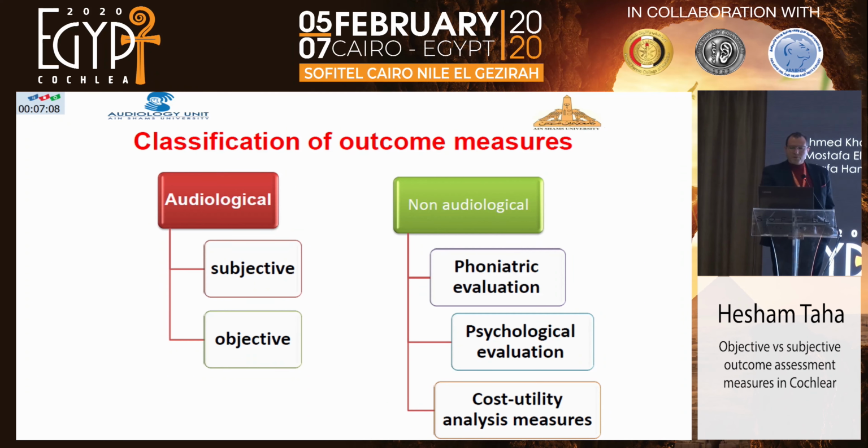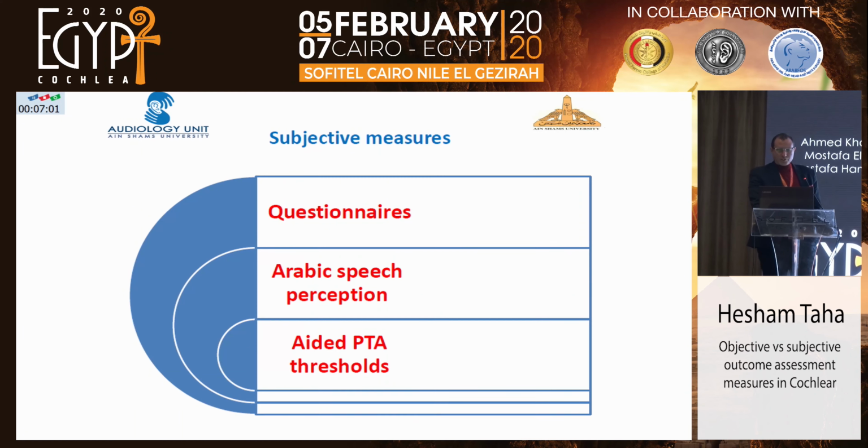There are many outcome assessment measures. Simply, you can classify them into audiological and non-audiological. I'm going to discuss only the audiological, which are subjective and objective measures.